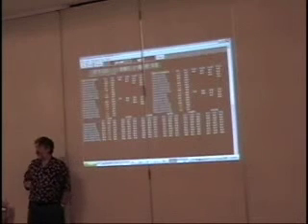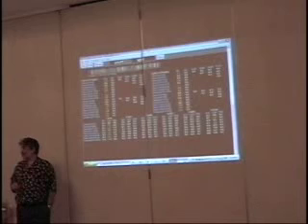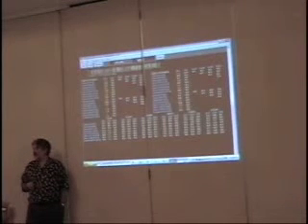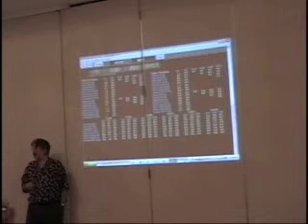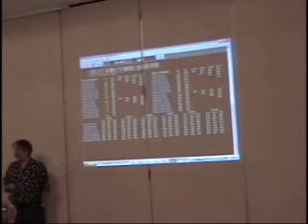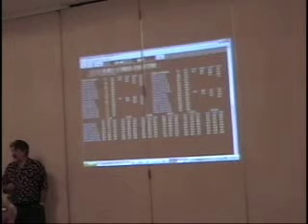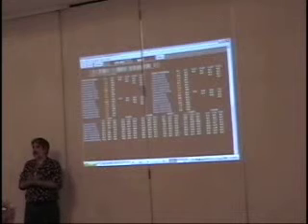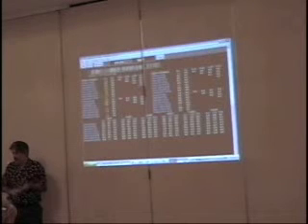Yes, Steve? When you pick percent Z okay, are the things like the sum channel and the 4-channel sum method and all that, are those automatically set? Well, they should be left off. No, they're not automatically set. But they would be left off. Leave them off. Absolutely. When you do z-score training, it's absolutely essential that you acquire the monopolar channels. You do not use sum channel mode. You don't do anything obscure.